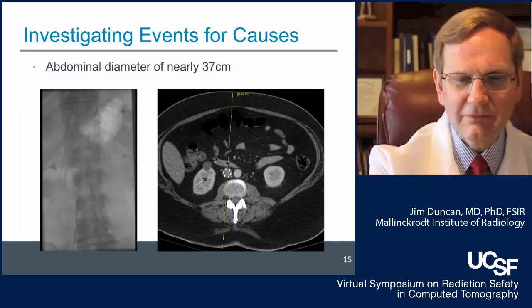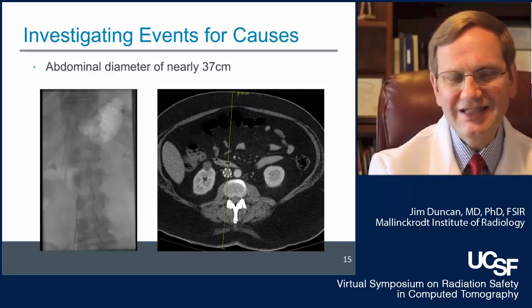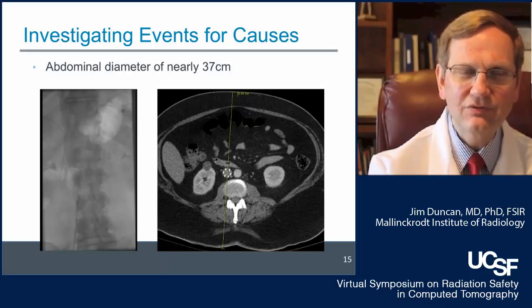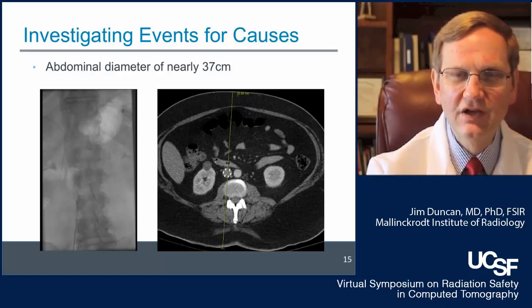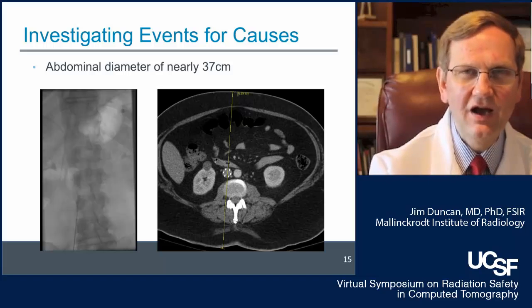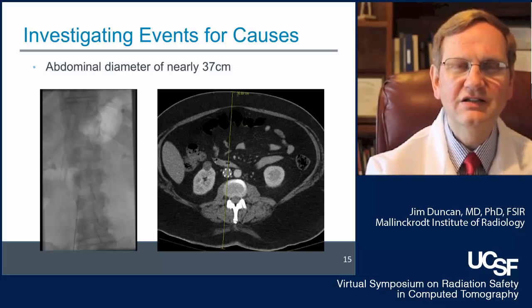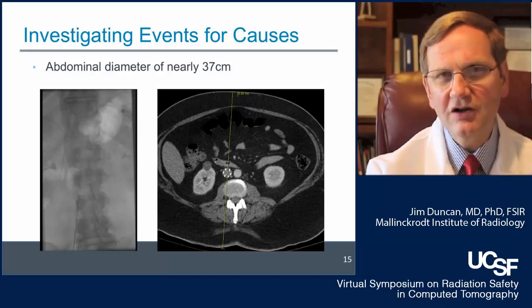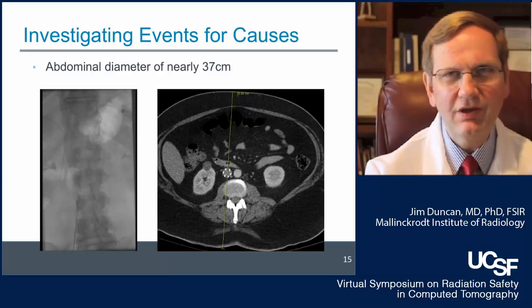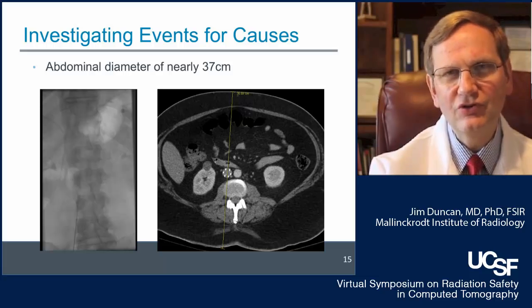But looking at what was driving dose, this was a big patient. When we look at a CT that was done shortly after the filter was placed, this patient is 37 centimeters front to back, and that clearly attenuates the beam, markedly increases reference point air kerma, and it's not that apparent to the operator when they're doing the procedure.